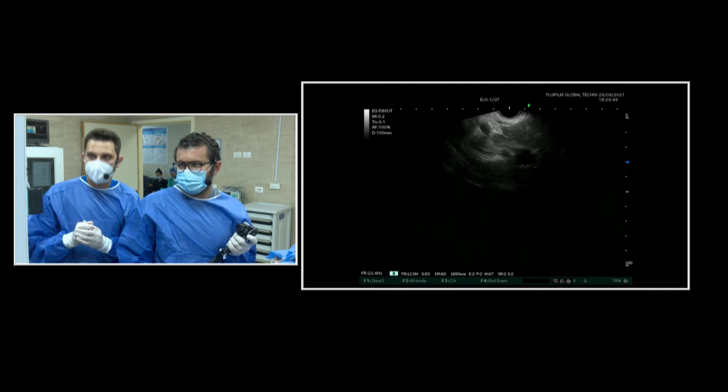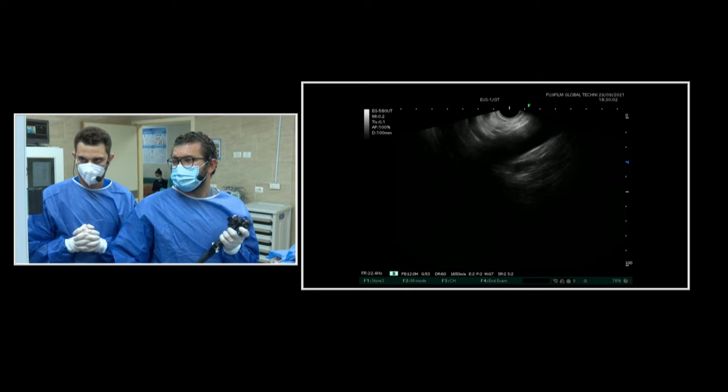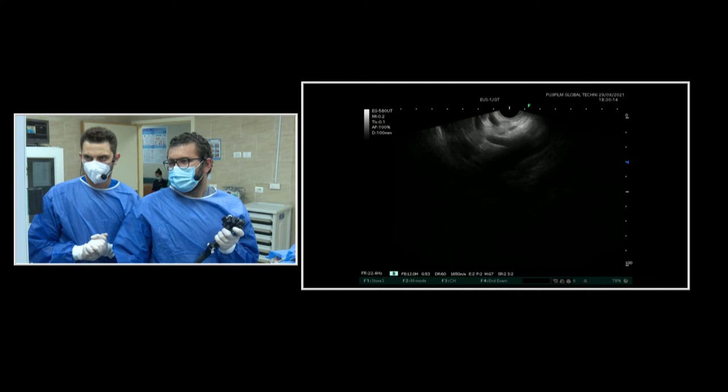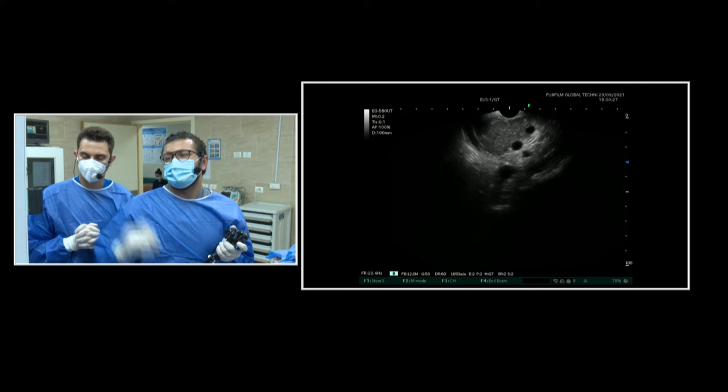They don't have any criteria of malignancy up till now. We will rotate clockwise and find the aorta, then push a little bit to find the origin of the celiac trunk — the celiac artery. Below the celiac artery, we will push a little bit more and find the body of the pancreas. This is a very good image. The body of the pancreas is usually bounded by the splenic artery above and the splenic vein below. In the center of the body, you'll find the pancreatic duct.